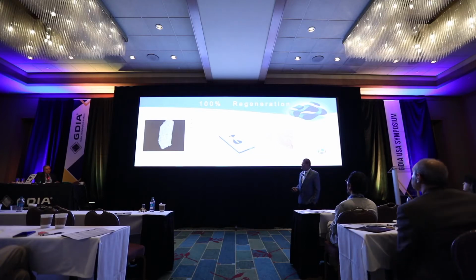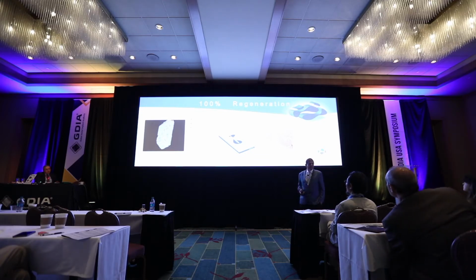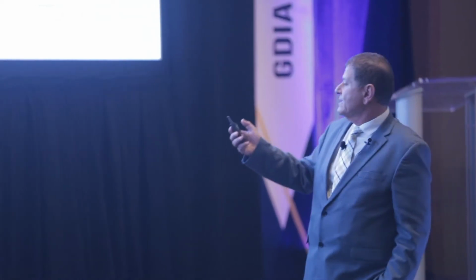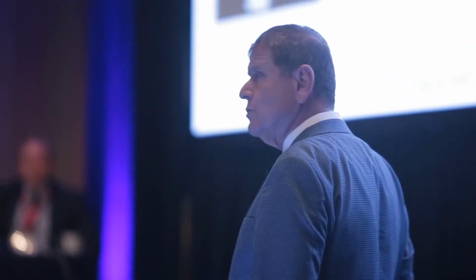And the result, 100% regeneration. We can see the microCT is the same form of the bone. We can see the histology. It's 100% patient-owned bone. And we can see the osteocytes, which reflect this is vital bone. 3 months are enough, the same as those 3 months when we don't do anything. We just leave the blood clot to do the work for us. 3 months are enough.